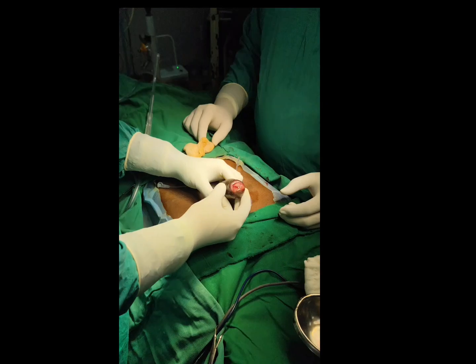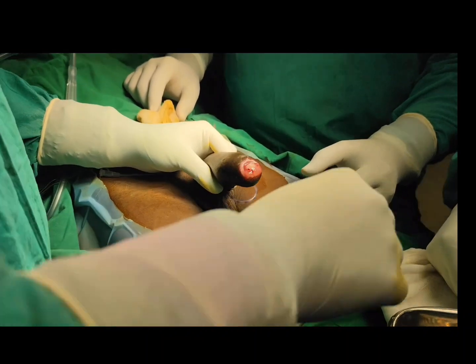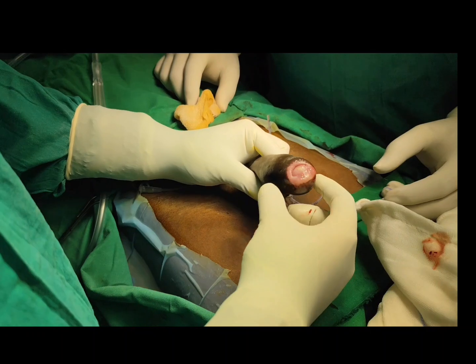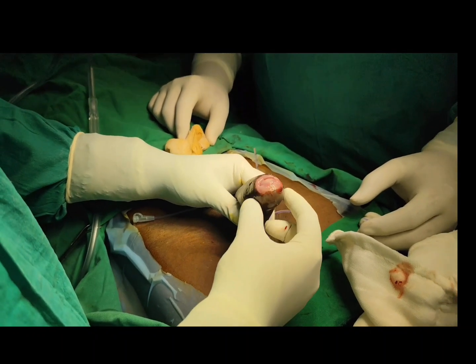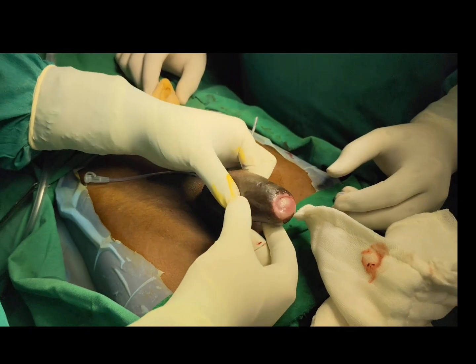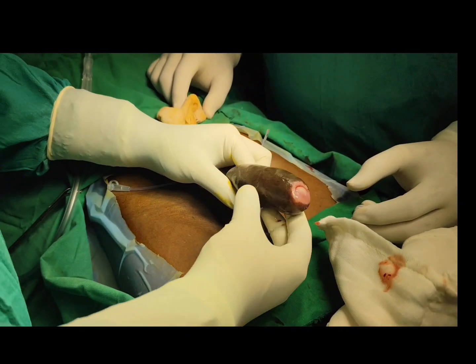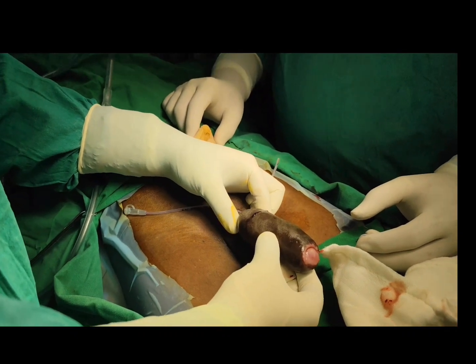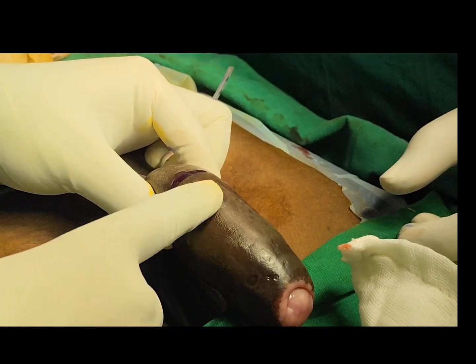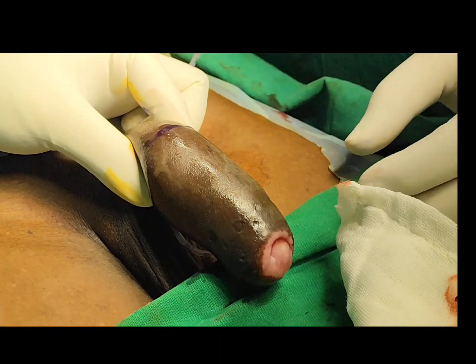Hello, today we are doing a case of carcinoma penis patient. Here we can see the squamous cell carcinoma of the penis involving the distal end of the penis, with an involved part of around 4 into 3 centimeter distally, and we have put a circumferential incision around 2 centimeter away from the distal part of the penis.